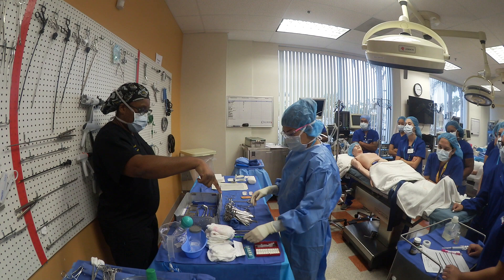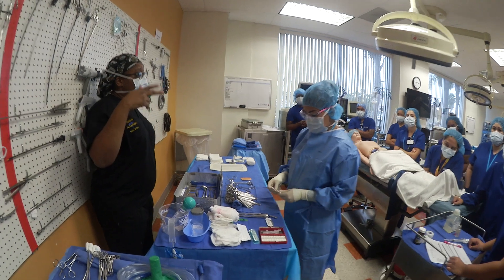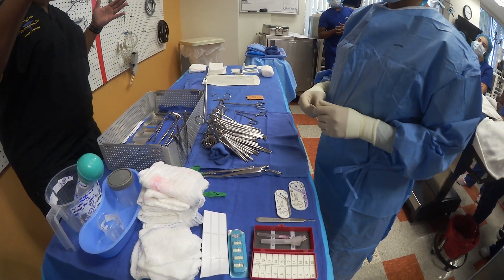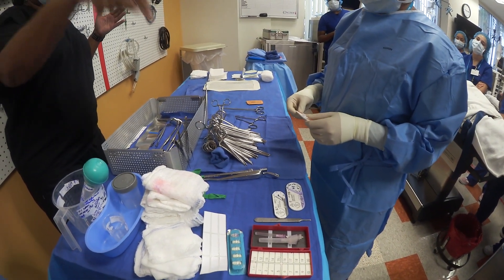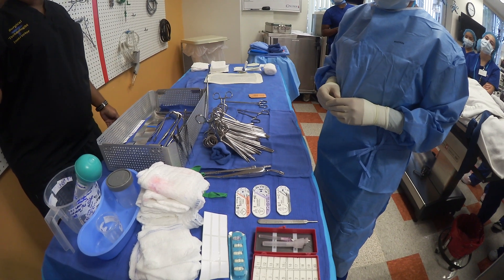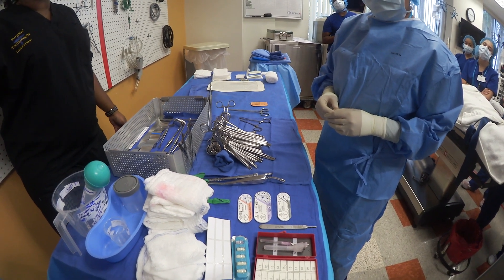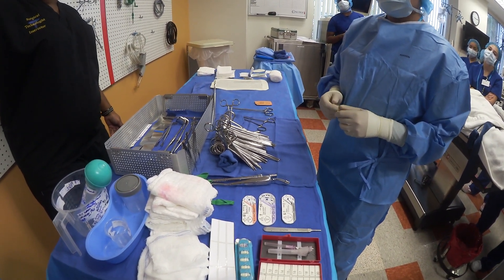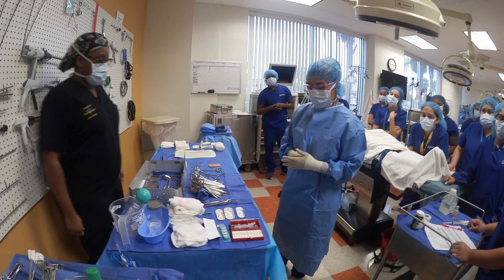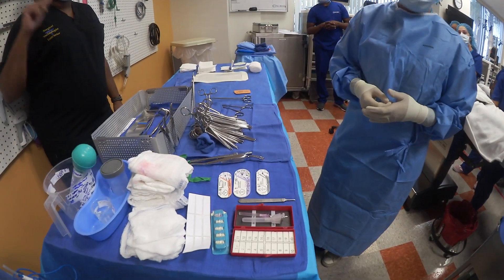Put that over here first, bring it closer to you. Then, the first layer that you're going to want to close is going to be with some type of Vicryl or something like that. Because I know she has a Vicryl up, I know that's going to be my starting closing stitch. Vicryl goes behind the PDS. The last thing we're going to use is a Monocryl. I know my doctor likes to close with a 4-0 Monocryl — we already checked the surgeon's preference card. Organize suture needle combination and organize sutures in order of use on the back table.